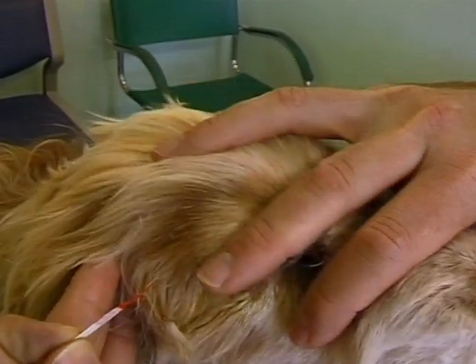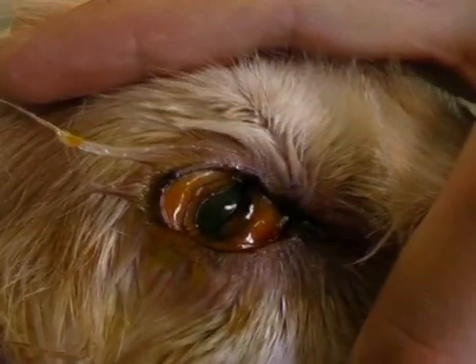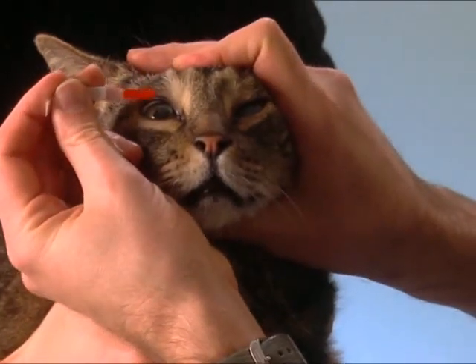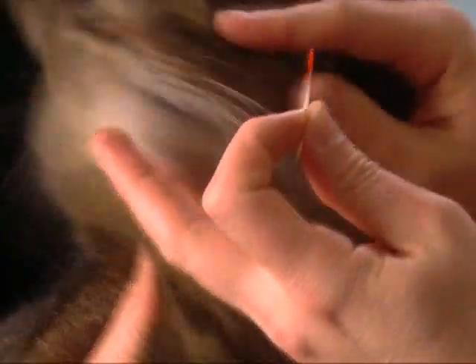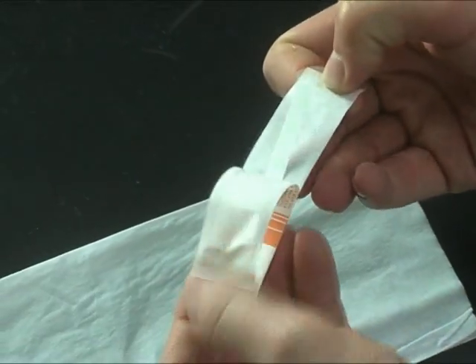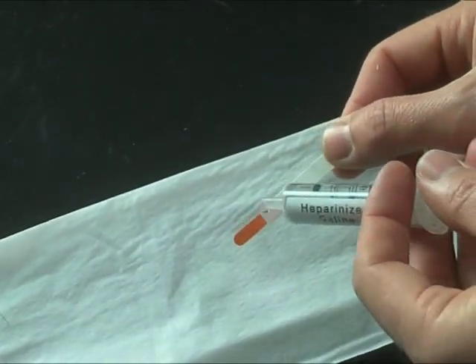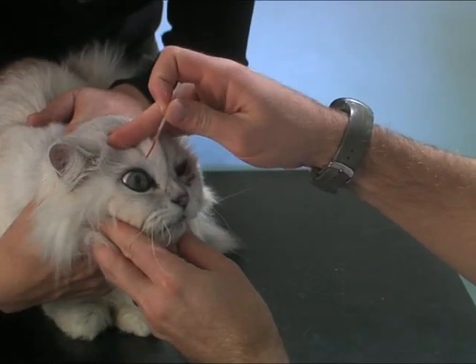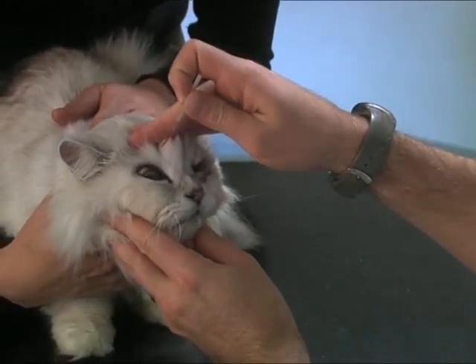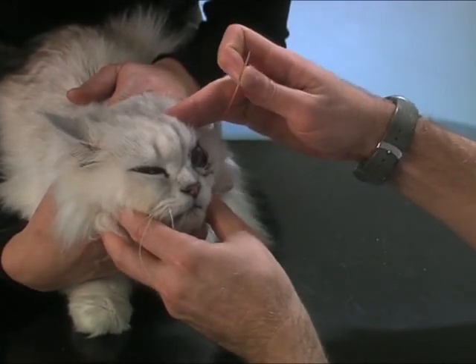Fluorescein testing is mandatory in cases presenting with ocular pain or inflammation. It is also useful as a routine test for assessment of corneal integrity. When fluorescein is used in strip form, the strip generally needs to be moistened before use. It is then touched to the surface of the eye. Both eyes should be tested and compared.